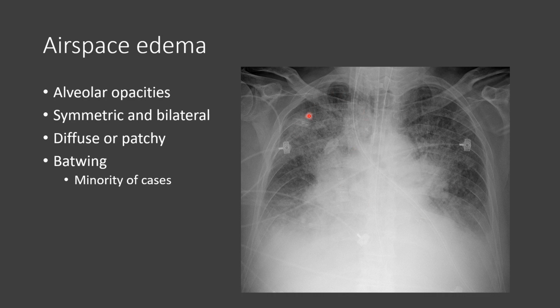But this alveolar edema tends to be more centrally located, and the reason for that is because the lymphatics are really robust out in the periphery of the lung, and so they can have this peripheral clearing. It actually pumps all the fluid out of the lungs, into the pleural space, into the lymphatics. And so you kind of get this peripheral clearing. And because you get peripheral clearing, you have more central opacity, right? And so it's this central opacity, these fluffy opacities in here.